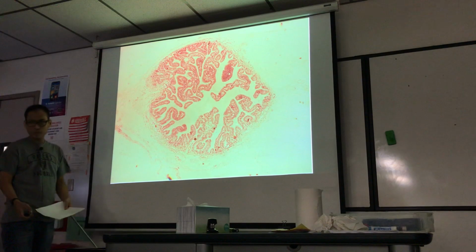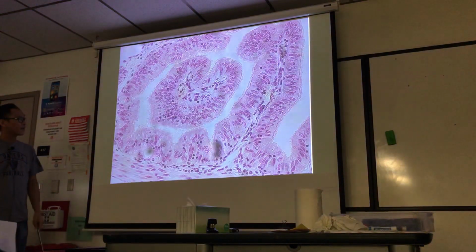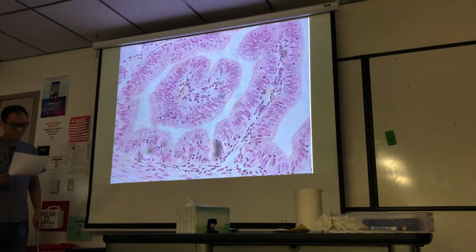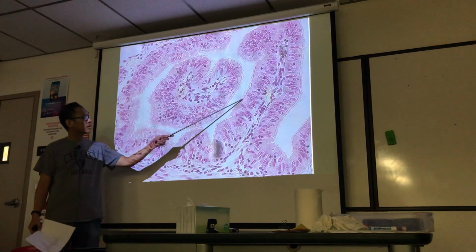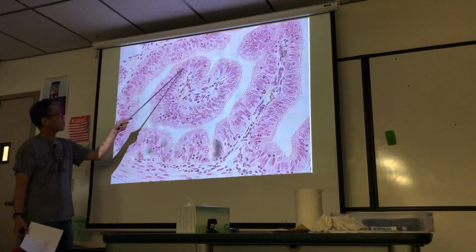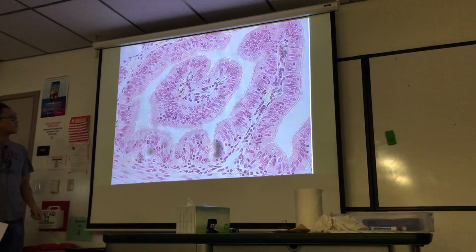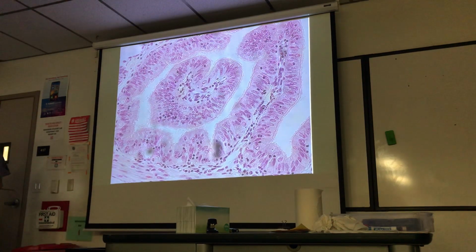If you zoom in close on the epithelium that lines the oviduct, it looks like that. Ciliated, pseudostratified, columnar ET. See the cilia there? And all the epithelium there, even around here in a circle, is all pseudostratified columnar ET. So that's a close-up of the oviduct.